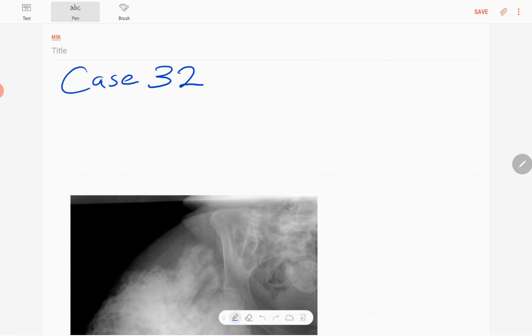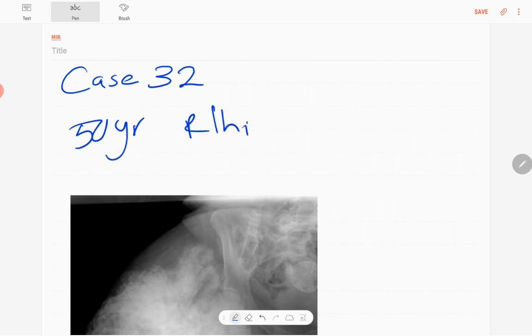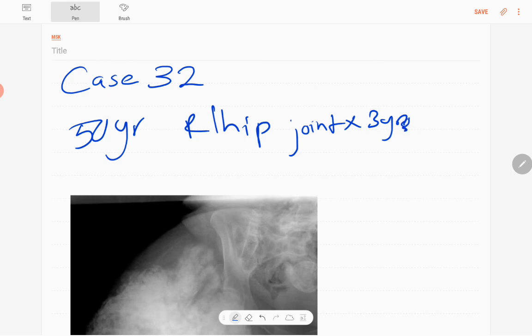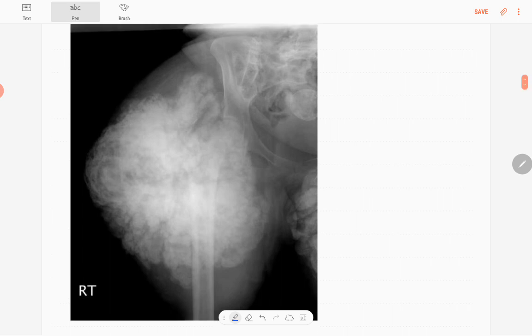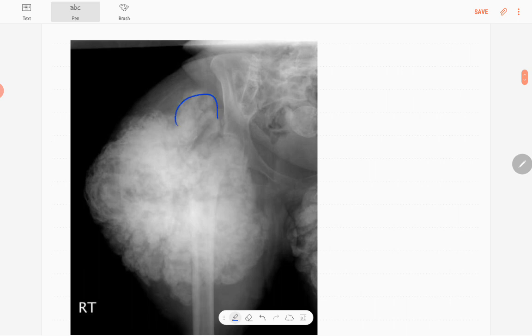Welcome back everyone. This is case number 32 of the MSK series. Today's patient is a 50-year-old female who presented with a progressively enlarging, painless lump at the right hip joint for three years duration. This is the anteroposterior radiograph of the right hip joint including the right upper femur. You can see the abnormality — it's a large mass.